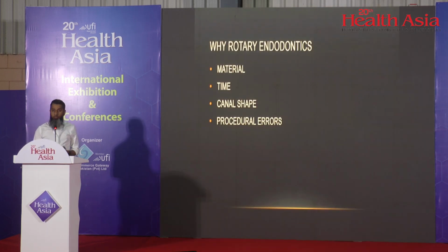So why should we opt for rotary endodontics? Okay, we have been doing manual endodontics since quite some time, and the success has been there. The main reason is now the change in the instruments or the materials of the files. Previously, manual instruments were mainly made of stainless steel.